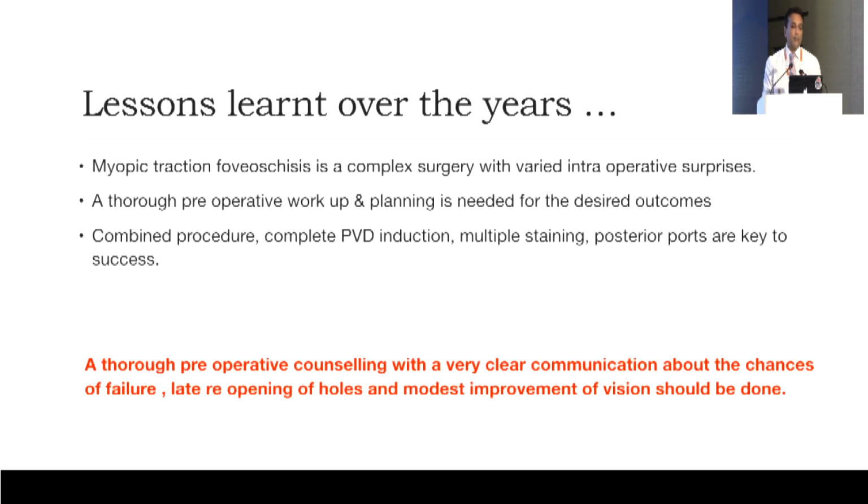So to conclude, lessons learned over the years are MTM is a complex surgery with varied intraoperative surprises. A thorough preoperative workup and planning is needed. Multiple steps are useful in the surgeries, like doing a phaco-vitrectomy, doing PVD induction with a combination of dyes, multiple stainings for a longer time, posterior ports. But the bottom line is a thorough preoperative counseling with a very clear communication about the chances of failure, reopening of holes, and modest improvement of vision should be done to the patient and their relatives.